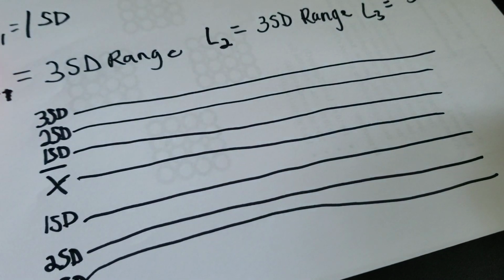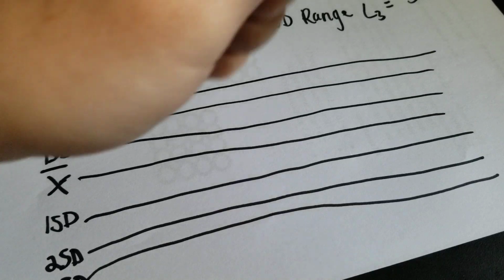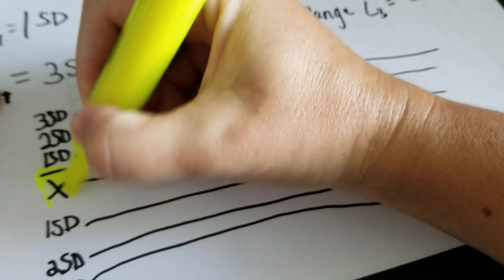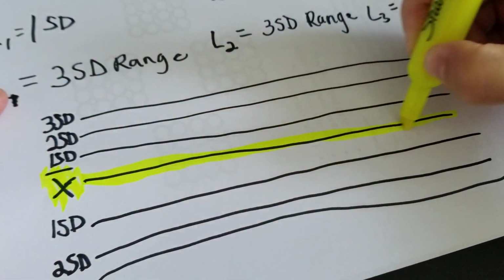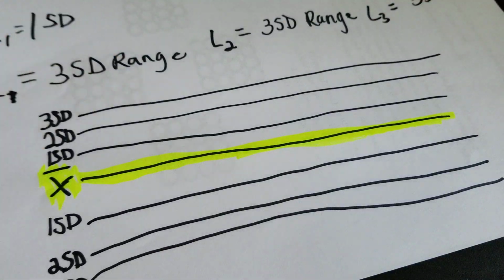Okay, so the main thing that you want to realize is when you're doing QC, you want it to be as close to the mean as possible, because that would be the highest level of accuracy when plotting out the QC.